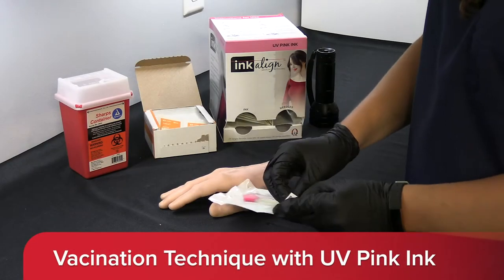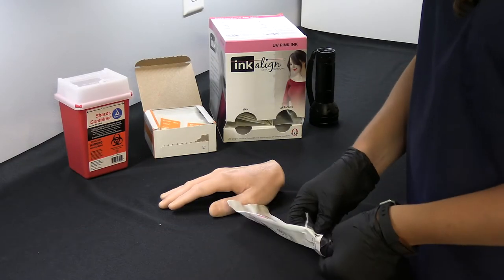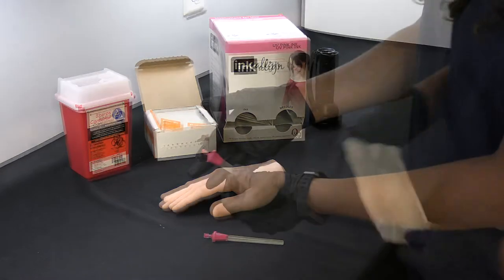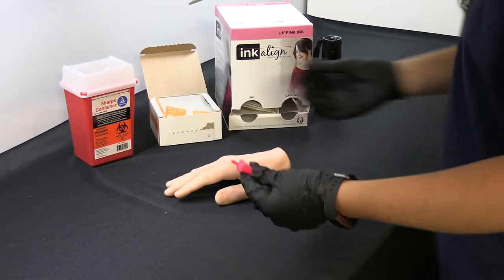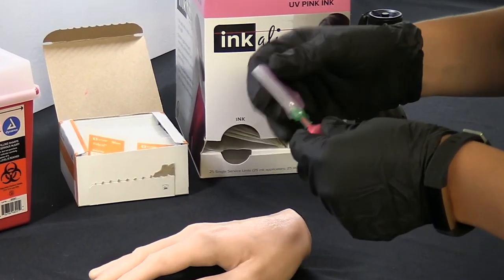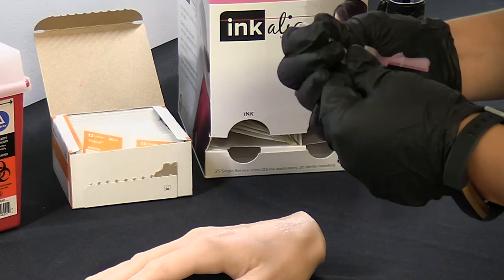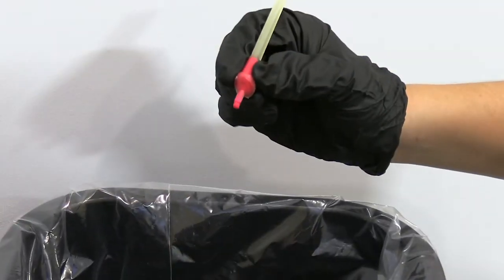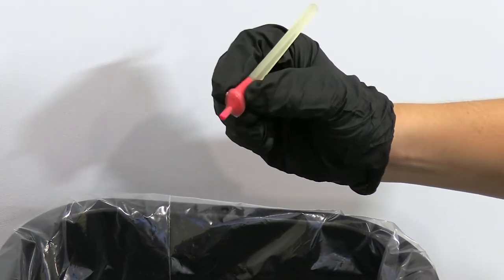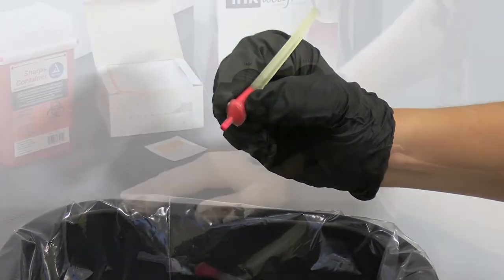Verify that the QFIX Incoline package is completely sealed and unopened. Then remove the device from the packaging and remove and discard the plastic cap. Best results are achieved with a short stem 21 gauge needle. Attach the sterile needle to the Incoline device. Hold Incoline at the ink bulb between your thumb and index finger, and over a trash receptacle, squeeze to produce ink drops from the needle tip.